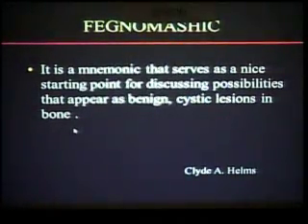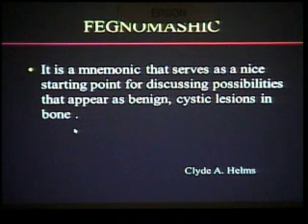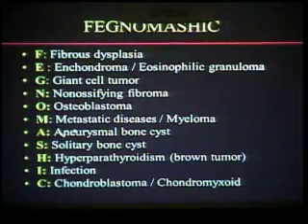All right, so this mnemonic is very useful. Ken was the one that started with this mnemonic, and I think it's very useful. Whenever you see a lytic lesion, you can do this. You can go over the differential diagnosis of any of these tumors.